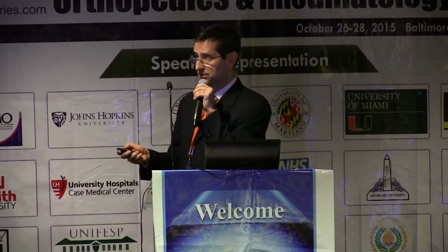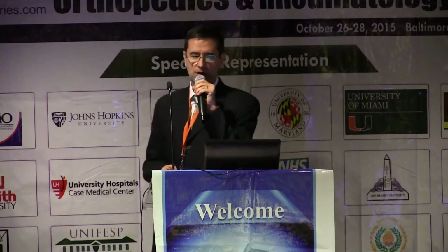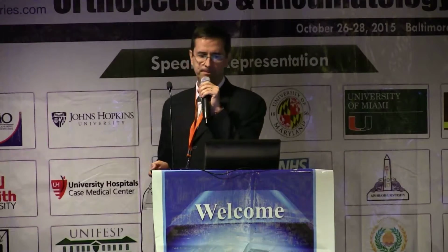Diagnosis is based on the clinical examination, aided by complementary exams such as electromyography and more recently by ultrasound. According to some recent articles, ultrasound can be used as a screening test, reducing the cost of diagnosis of carpal tunnel syndrome.